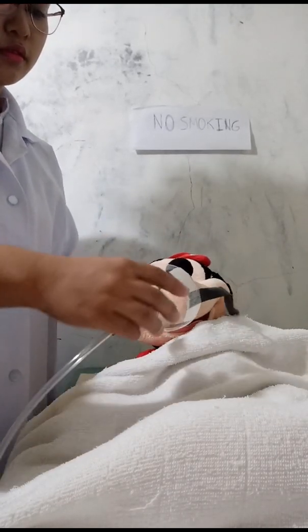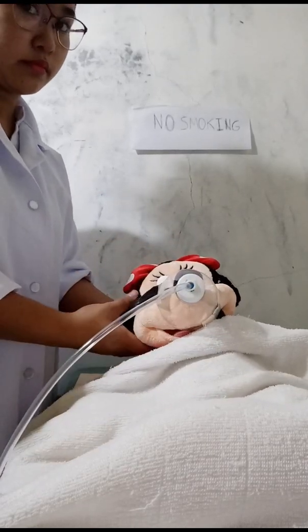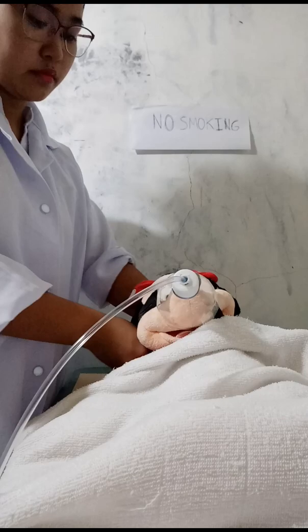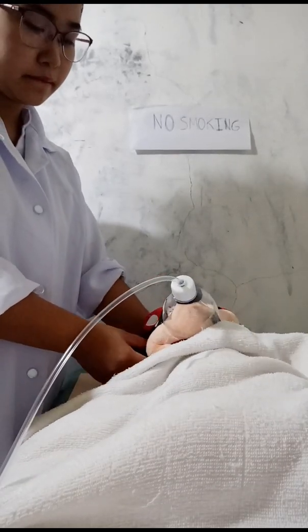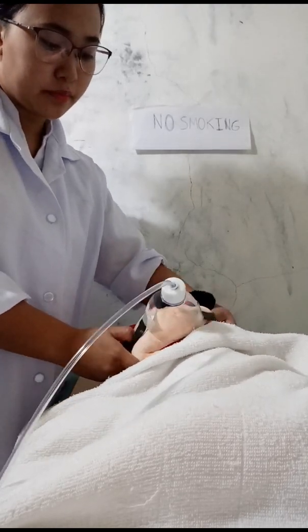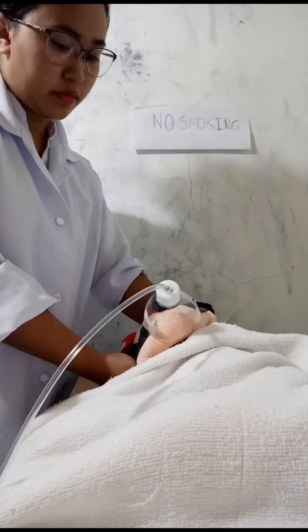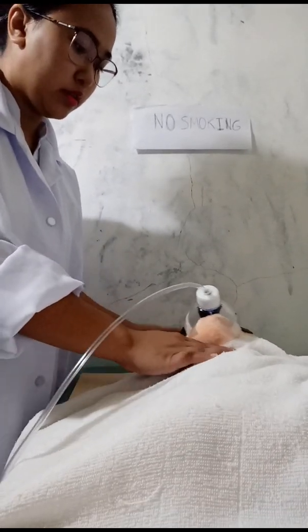Yan. Lagay ko na po yung mask, ha. Ma'am, masikip po ba? Okay lang po ba? Okay po. Higpitan ko pa po ba? Yan.